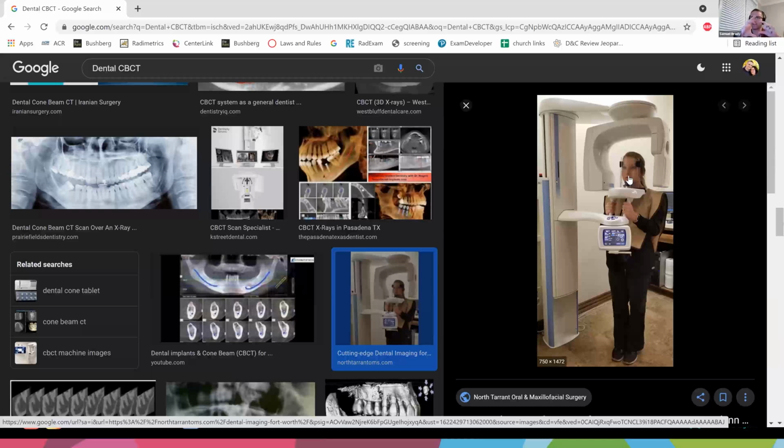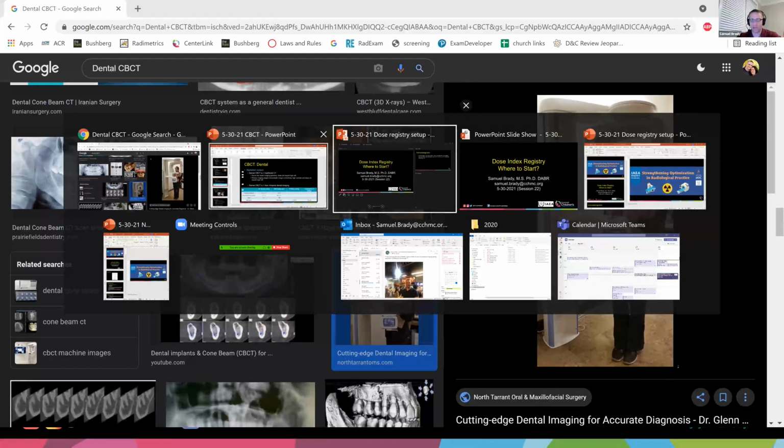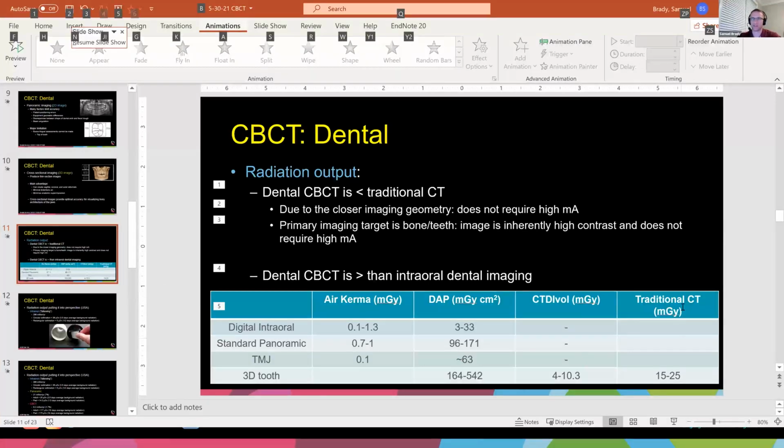And then you'll know if your 10 centimeter probe, your ion chamber, will cover that, or if the field of view is larger, because maybe your system is larger. And if that's the case, there's nothing else you can do. You still use the chamber, you still make the calculation, but you just have to know then that when you compare these two numbers, they will not be as accurate to compare. Because a traditional CT scanner, when we're calculating CTDI for a maxillofacial or a more coned-in protocol, those are going to have maybe 4 centimeter, maybe 8 centimeter fields of view, in which case they're always going to be smaller than the 10 centimeter chamber, unless you're using one of the newer systems, which is 160 slices, or 16 centimeters.